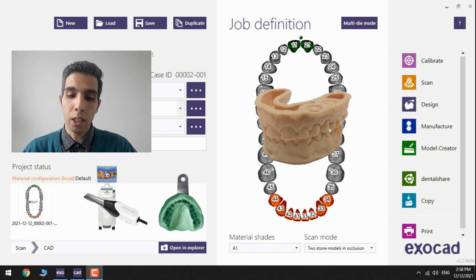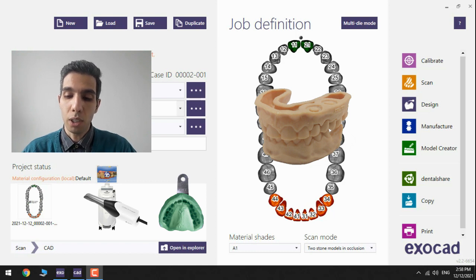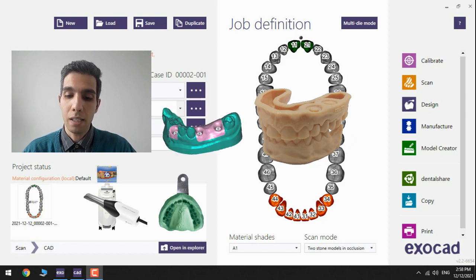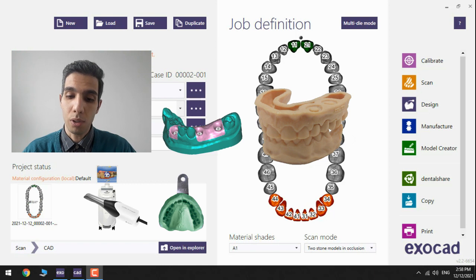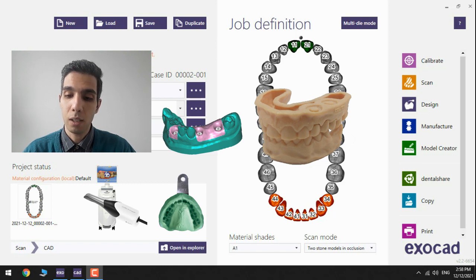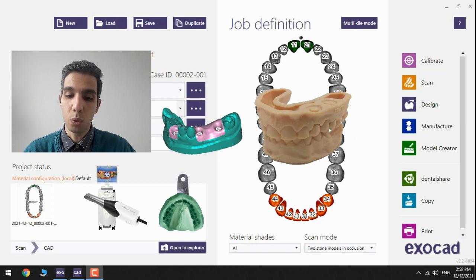In the upcoming videos you will find how to design models for implant cases using lab analogs and also add removable gingival mask or use the individual abutments you design yourself as dies.